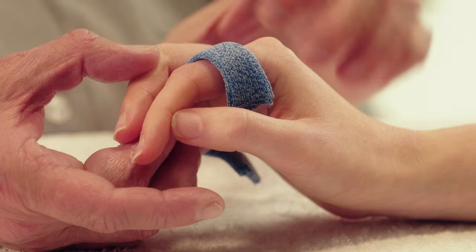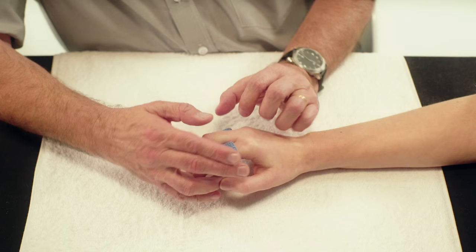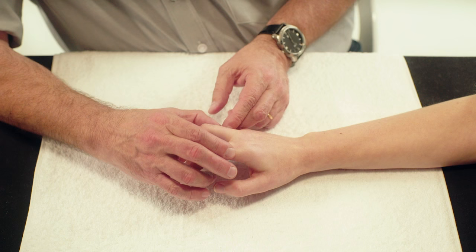Carefully mould the contours of each finger into the material, thus making sure that each finger easily finds its place.